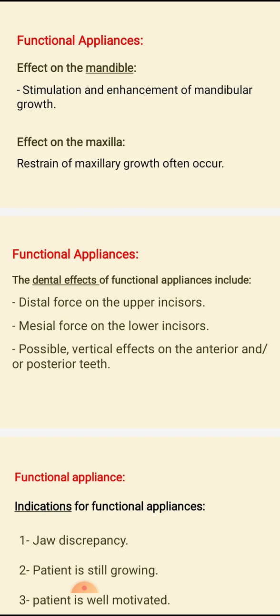Okay. What about the dental effects? The dental effects include distal force on the upper incisors, mesial force on the lower incisors, and vertical effects on the anterior and the posterior teeth.